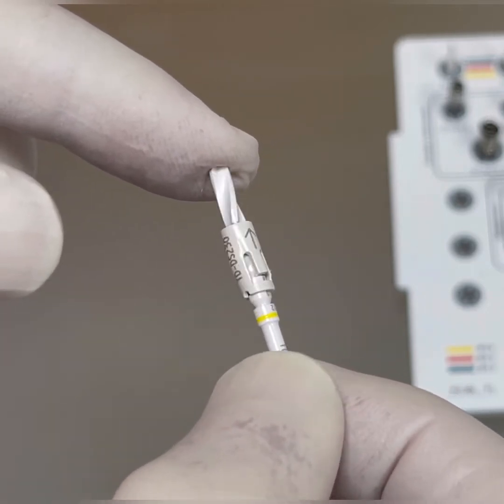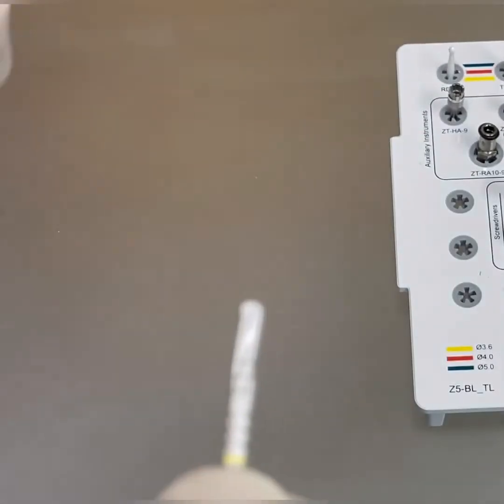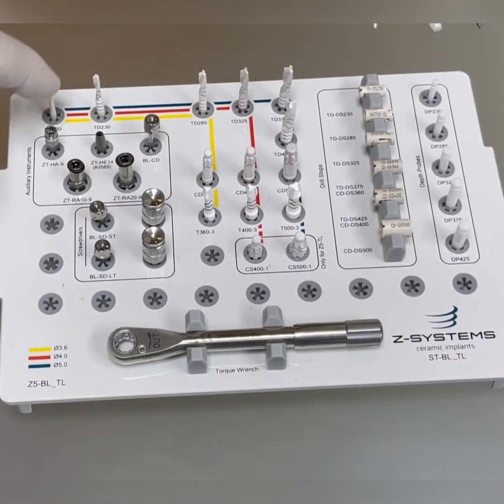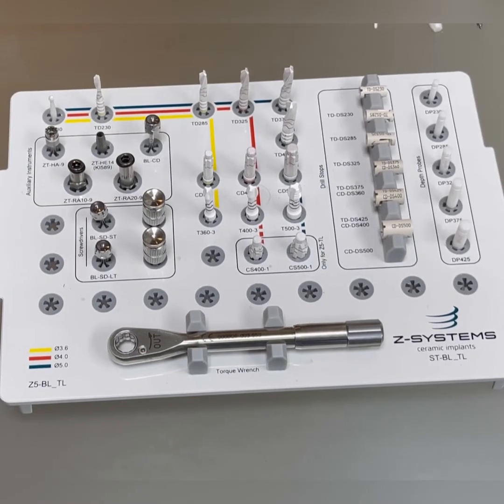After using the drill, we remove it from the front. These first three drill bits are used with 600 rpm speed. As we progress to the thicker drills, we drop down to 300 or even 200 rpm.